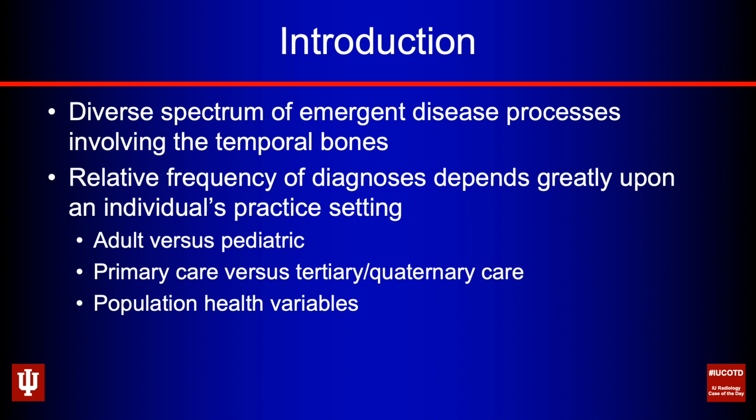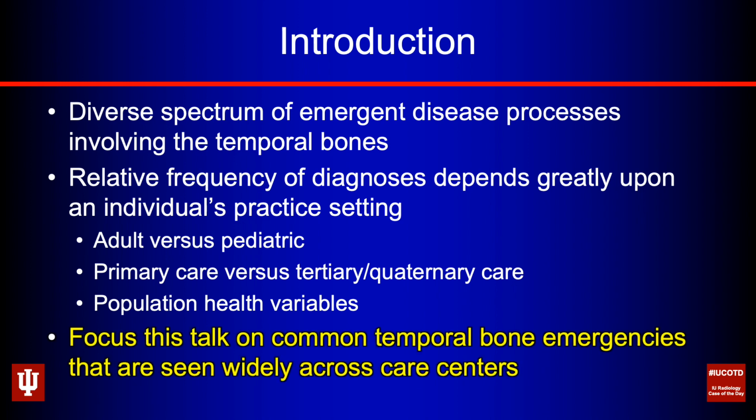But the focus of this talk is going to be on what I think to be common temporal bone emergencies that are seen fairly widely across all care centers. These are things that you should know about, you should be aware of, you should know how to interpret the studies, and give the referring doctors the information that they need for their next steps in management.